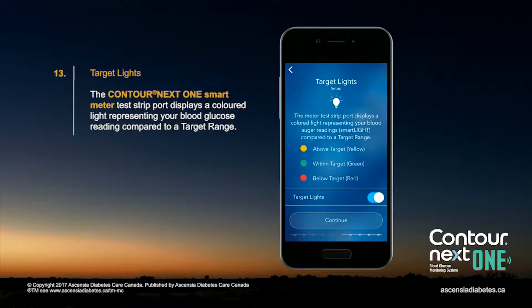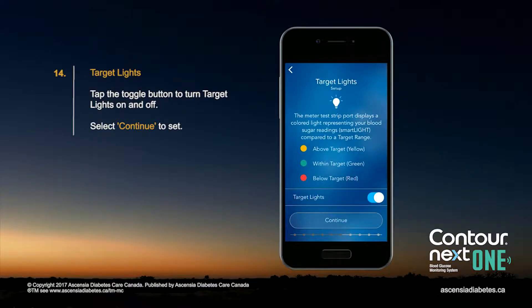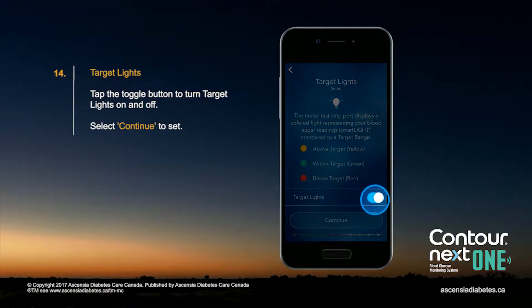The test strip port displays a colored light representing your blood glucose reading compared to a target range. Tap the toggle button to turn target lights on and off, then select Continue.